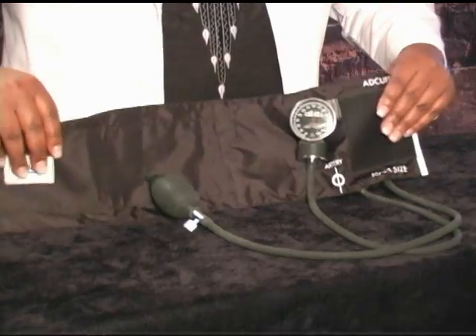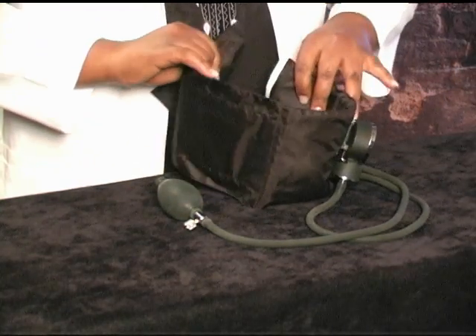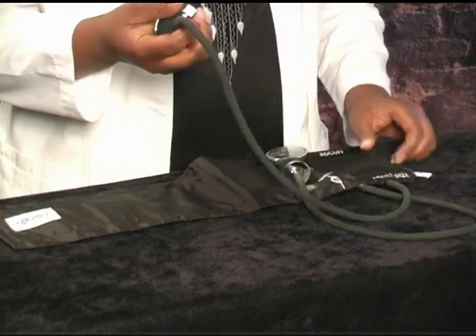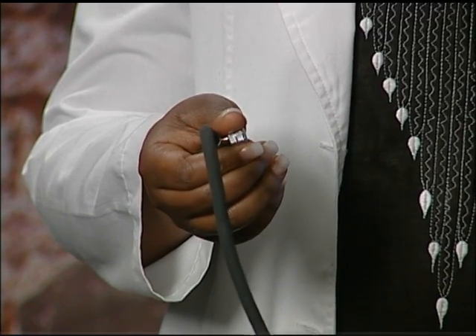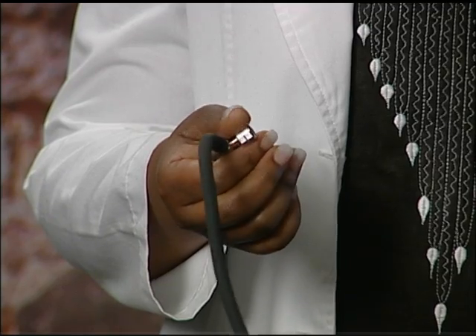You will need a stethoscope and a blood pressure cuff in order to measure blood pressure. This is a blood pressure cuff. It has the cuff or bag part which wraps around the arm. It has a bulb which is used to pump air into the bag. The bulb has a screw valve which you can use to let the air in or out of the bag.